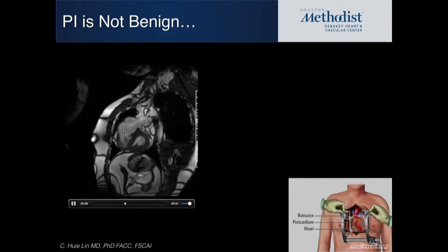And as you can see, the entire right ventricular outflow tract as well as the right ventricle has severely dilated in response to a lifetime of pulmonic regurgitation. In fact, you could argue that there's really no valvar apparatus whatsoever. And at this point, what's happened is the right ventricle is enlarged so much that it's compressing on the left ventricle and it's taken up much of the chest.